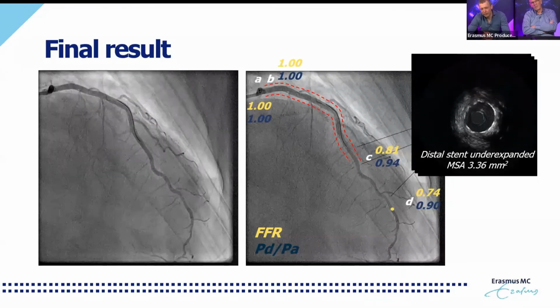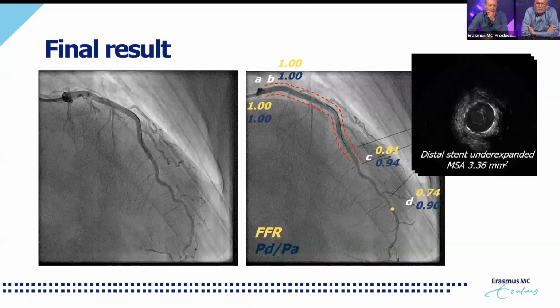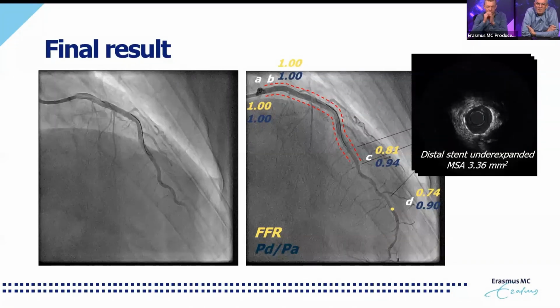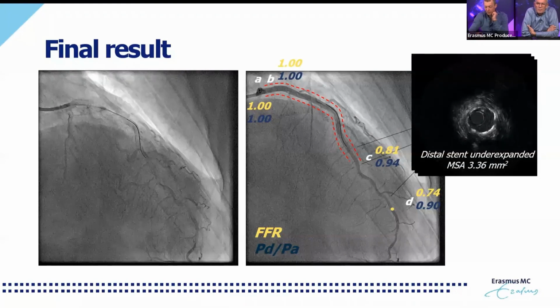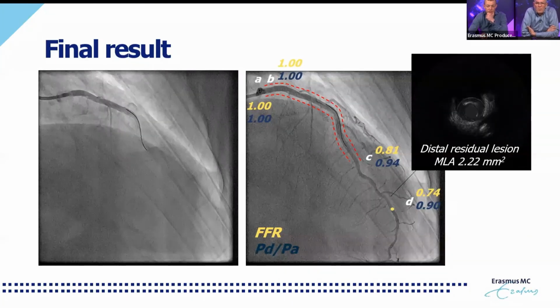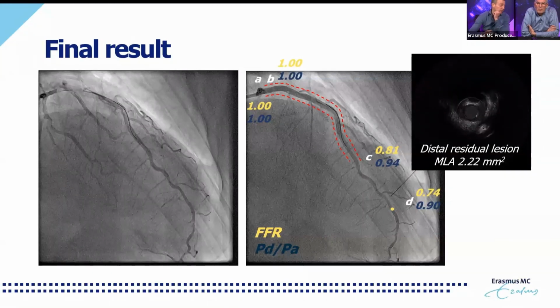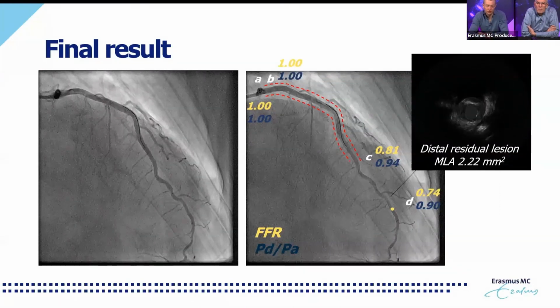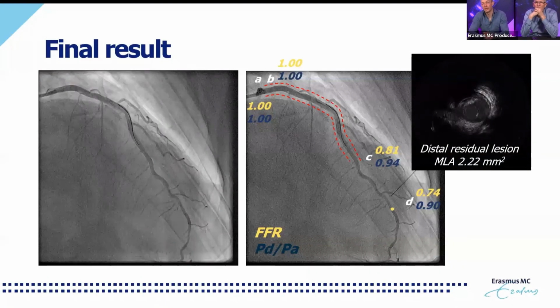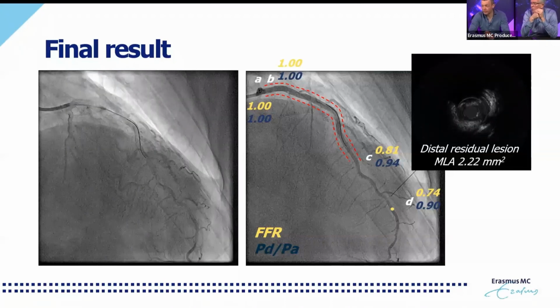But the point is that physiologically, the disease here distally was quite significant, and you could obviously argue whether, if you would have optimized this stent, let's say to a minimal stent area of 5, and you still know that you have distal disease with areas of around 2.2 here where the yellow dot is, how that would help the patient is perhaps a bit arguable. But again, that's the reason we're doing these trials. We learned that if you have many operators, people work in many different ways, despite strict study protocols. And we still have to learn what type of maneuvering or optimization really helps to improve the outcome of the patient. So with that, we are at the end of our case series.